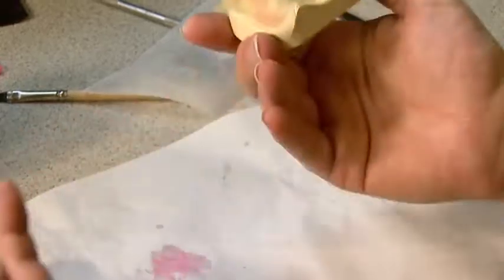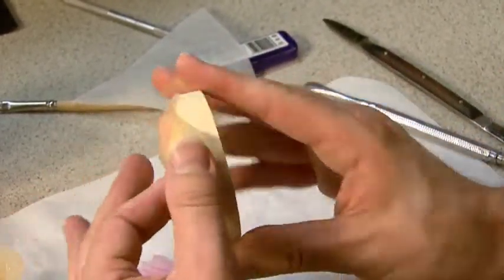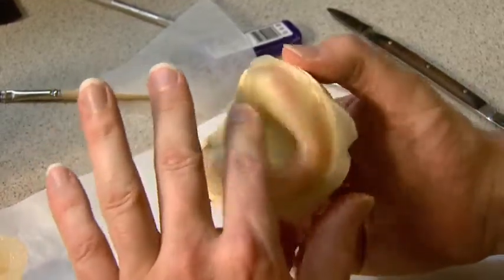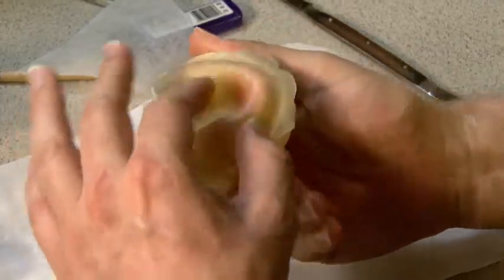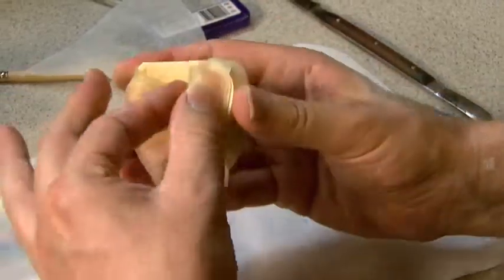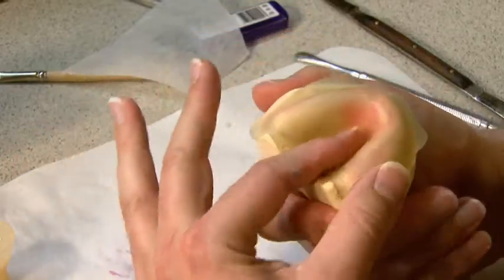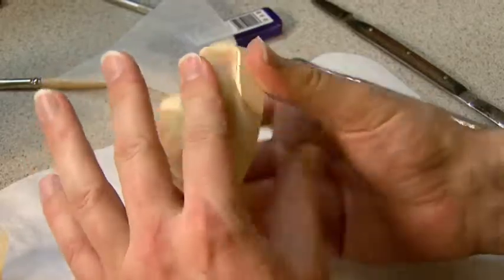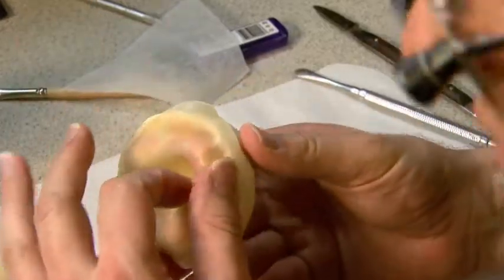Another technique is to simply fabricate a definitive base plate out of the same acrylic resin that you're going to utilize for the final denture. You can do complete setups on that also and get very, very good record bases that way. It's a technique that some prosthodontists enjoy. You can fabricate a definitive base, wax to that base, and then process on top of that definitive base.